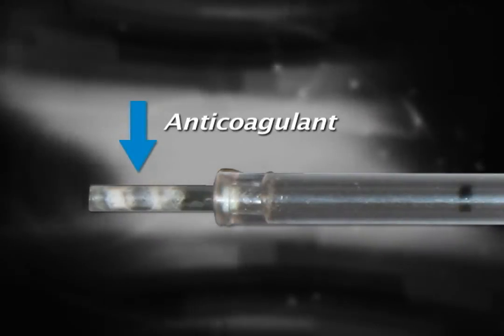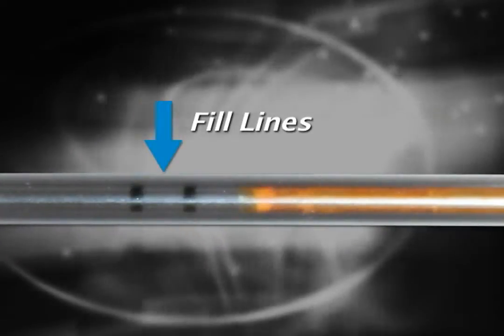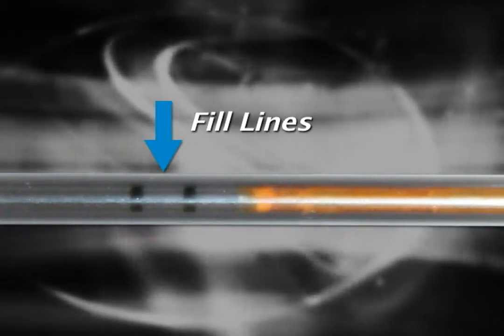At the end of the tube you will notice a white powder. This is an anticoagulant mix of EDTA and heparin. The two black lines are fill lines. Collect your sample until it fills between these two lines, which is approximately 65 to 75 microliters of blood.